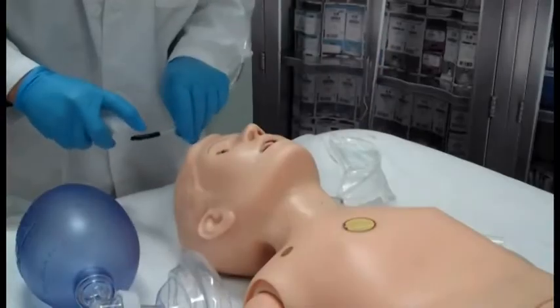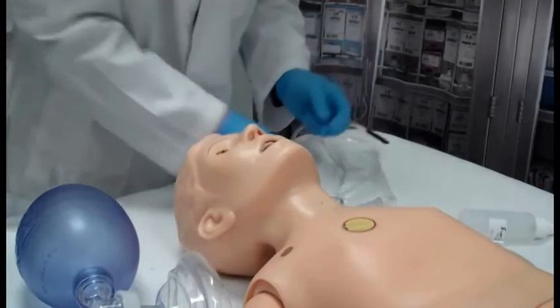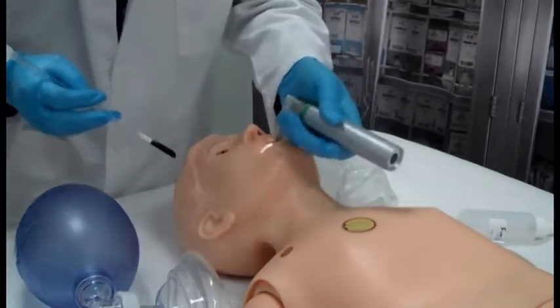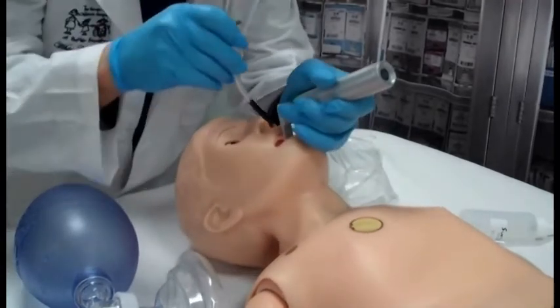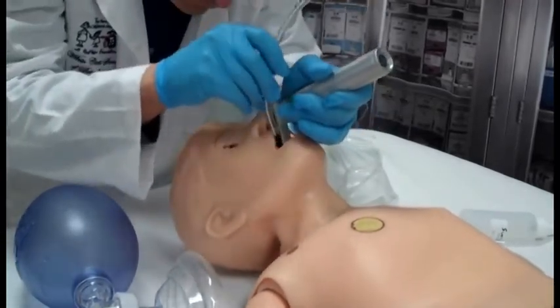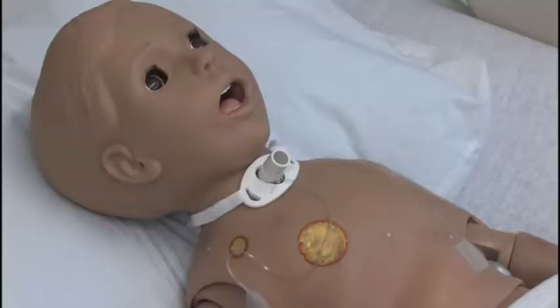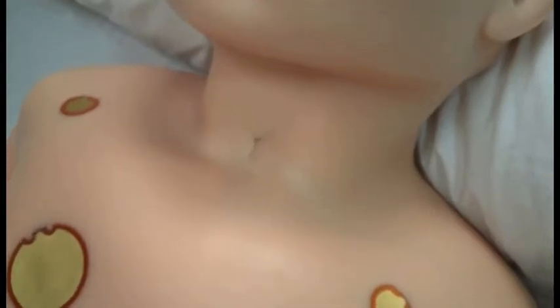Our pediatric mannequin is a 50th percentile 5-year-old and has many unique capabilities. Ralphie can be intubated orally and nasally through his left nare, although you may need to lubricate the airway adjunct with silicone oil prior to any intubation attempt. Please do not use lubricating jelly on any of the mannequins, as it is very difficult to clean the airways. A tracheostomy tube can be placed in the pre-scored tracheostomy insertion site.